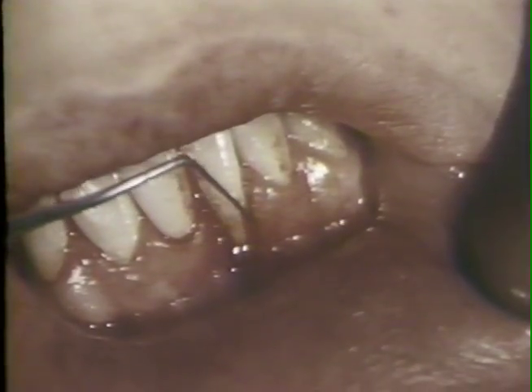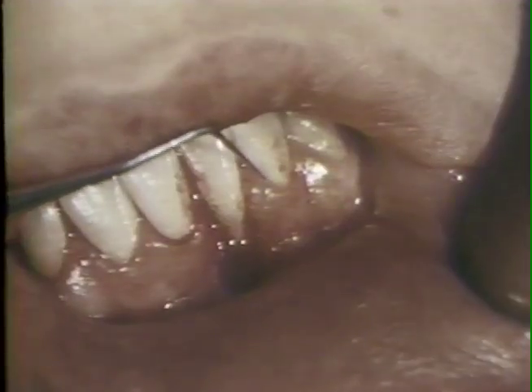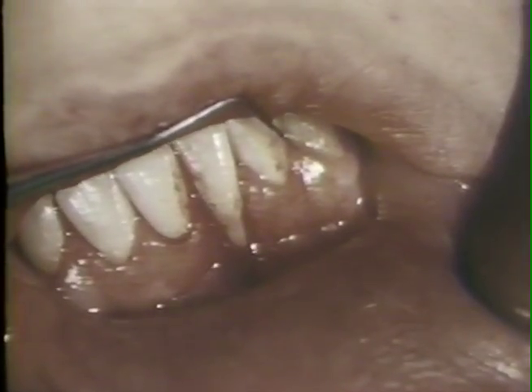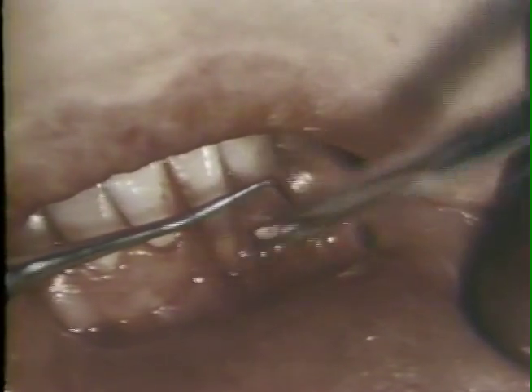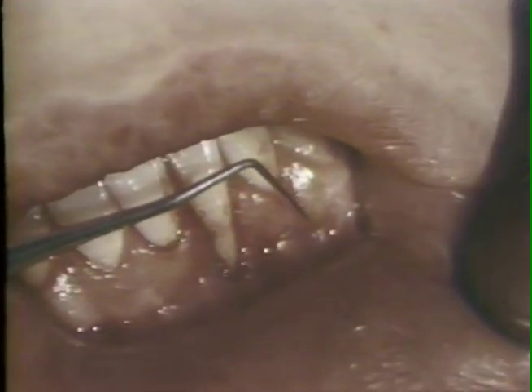The second incision is outlined with a periodontal probe starting at the distal aspect of the cleft, extending into the gingival sulcus of the lateral incisor, over to the cuspid, and down vertically to the alveolar mucosa at the mesial-buccal aspect of the cuspid, with a slight releasing incision into the alveolar mucosa.